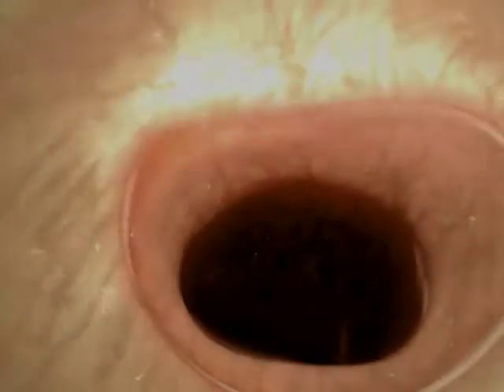Module 4: Polyp resection and removal. Colonoscopy gives us the opportunity not only to identify polyps, but also to remove them.